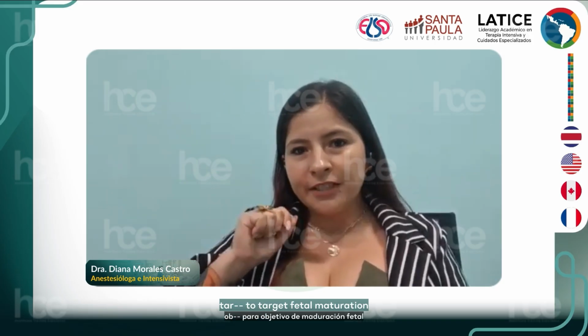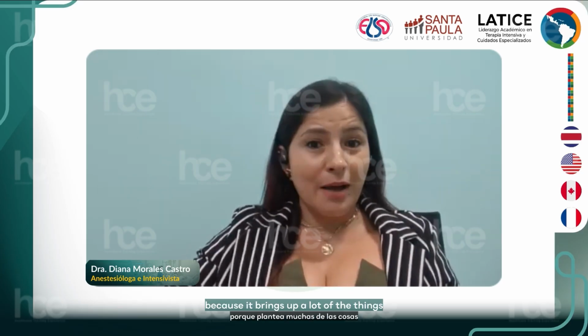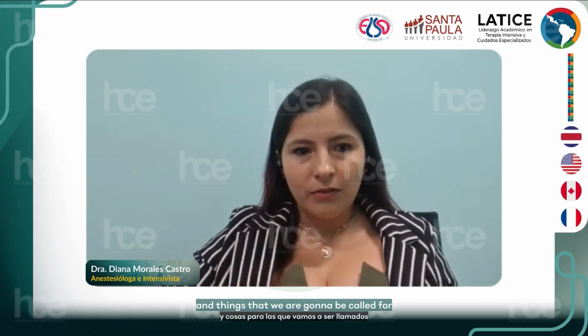And they're asking if we would use ECMO, not as an exit strategy for her, but to target fetal maturation. In this case, it was very open, and we never ended up having to make the decision whether the patient would or would not go on ECMO. But I thought it was a very interesting case to open up because it brings up a lot of the things that we say are contraindications, but it also opens up a very contemporary topic and things that we are going to be called for.